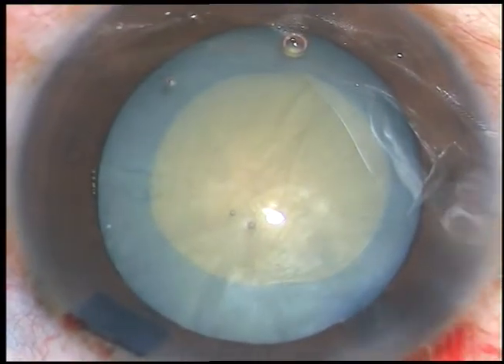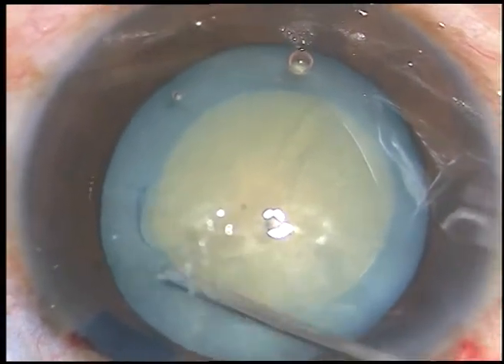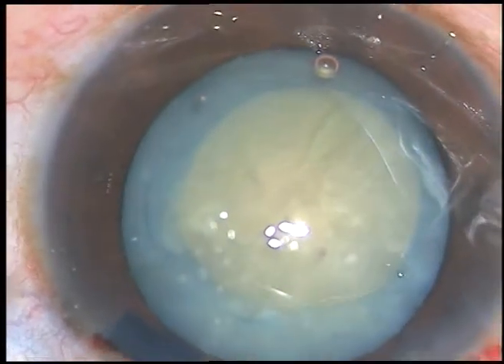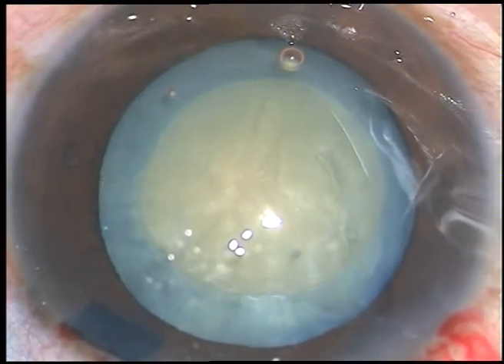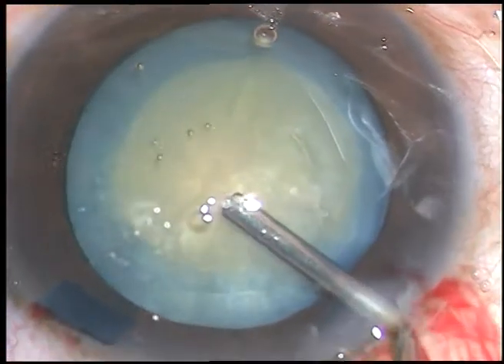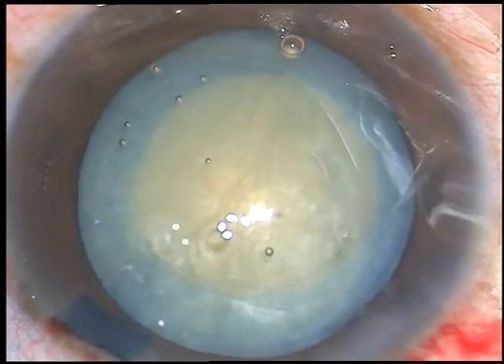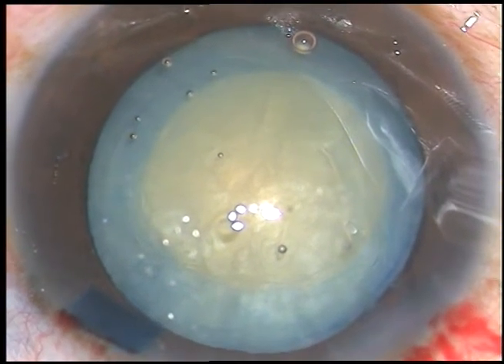We can complete the case through this rhexis because the cataract is not very hard. It is a medium density cataract — nuclear sclerosis is about grade 3 plus.